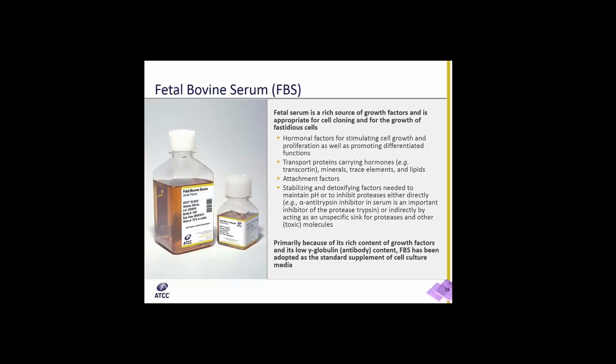Fetal bovine serum. This is a rich source of growth factors and is appropriate for cell cultures and for growing viruses. The serum serves as a source of many important ingredients that are hard to replace, and primarily because of its rich content of growth factors and low gamma globulin content, FBS has been adopted as a standard supplement of cell culture media.